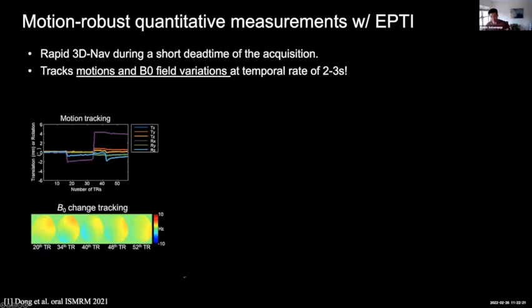Another important area that we've worked on is to be motion robust as well, to get precise quantitative acquisition in the clinical environment. In this case, we've added in a rapid 3D navigator during the short dead time of our EPTI acquisition as we wait for signal recovery.